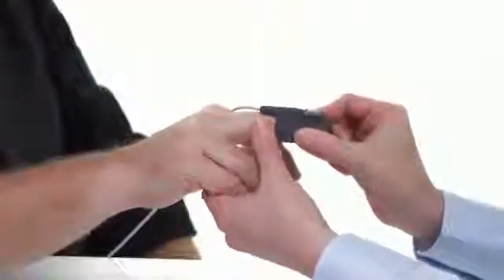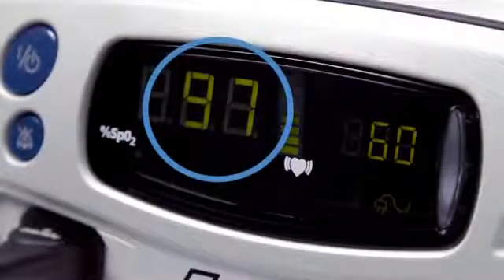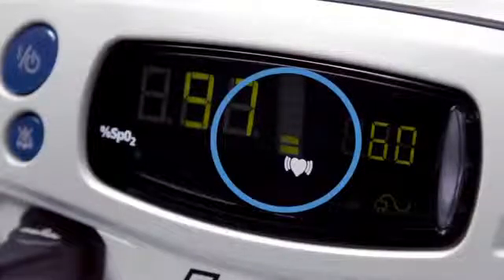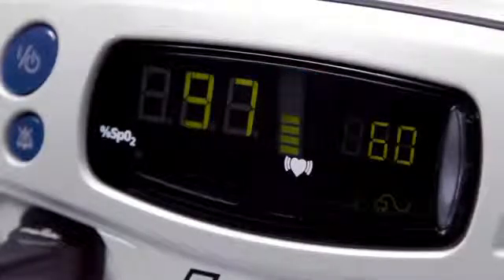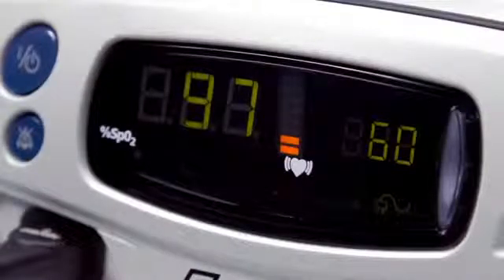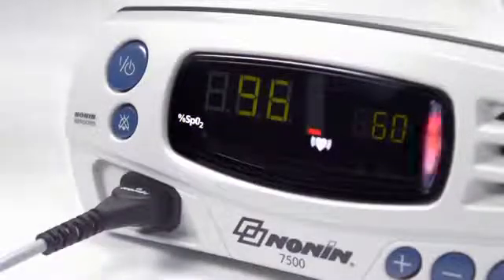After the startup sequence, the oximeter will start displaying and recording SpO2 and pulse as soon as the sensor is placed on the patient. The SpO2 level is shown on the left side and the pulse rate on the right side. The pulse strength signal bar in the center indicates signal quality: green bars indicate a strong pulse signal, amber indicates a marginal pulse signal, and red indicates a low pulse signal. It is a good idea to check pulse signal quality at startup and adjust the sensor for a stronger reading if necessary.